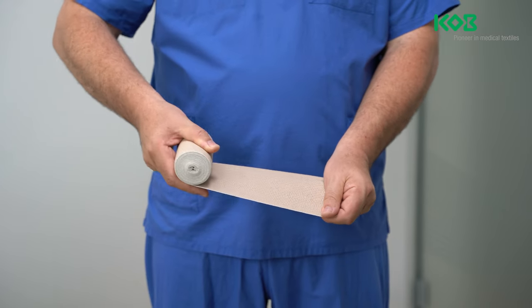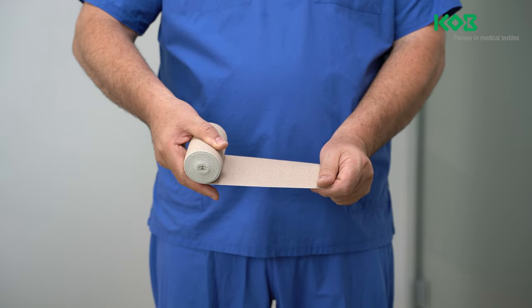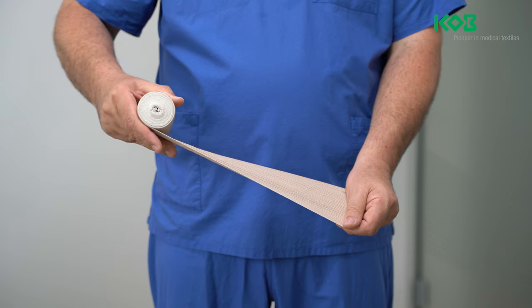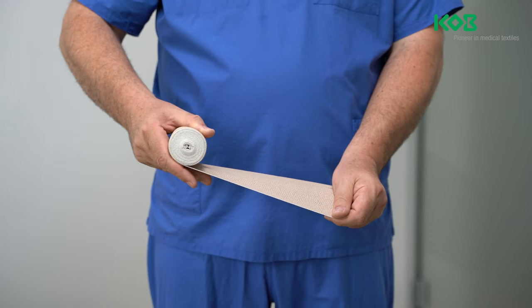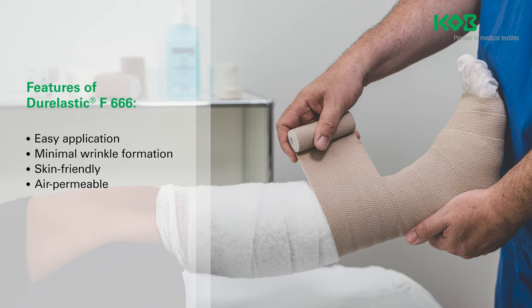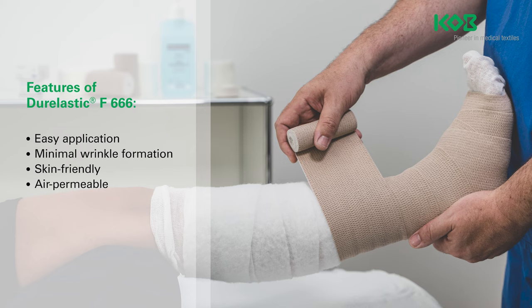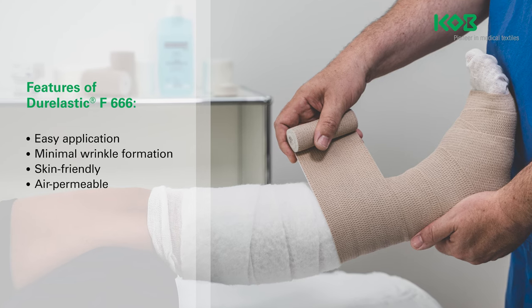Dura Elastic F is indicated for an ankle brachial pressure index (ABPI) of 0.8 to 1.3. Long stretch bandages can also be used as a support and relief dressing for injuries of the musculoskeletal system. Compression bandages with Dura Elastic F are suitable for immobile patients.